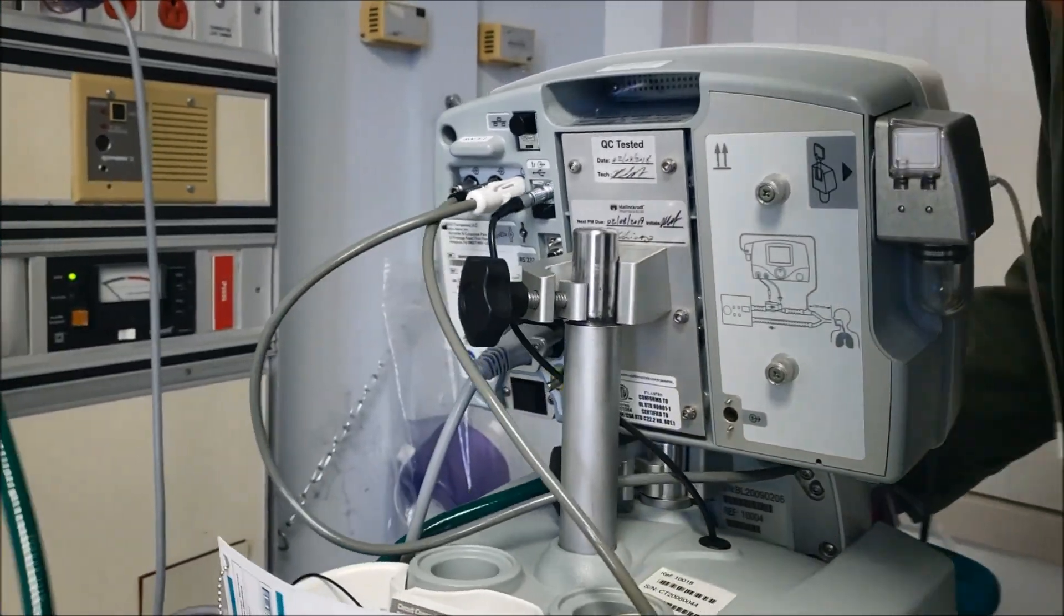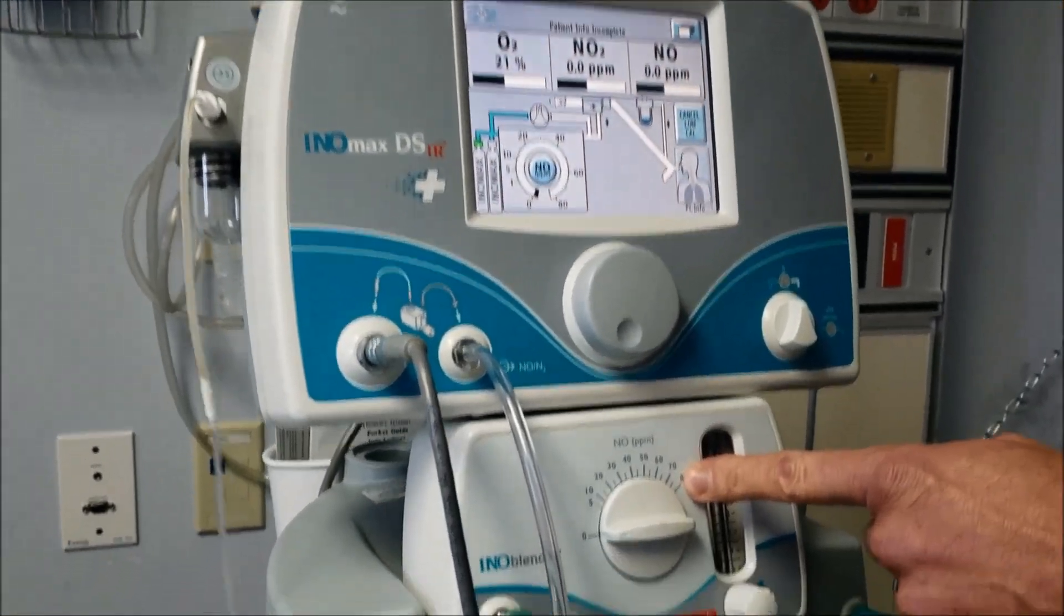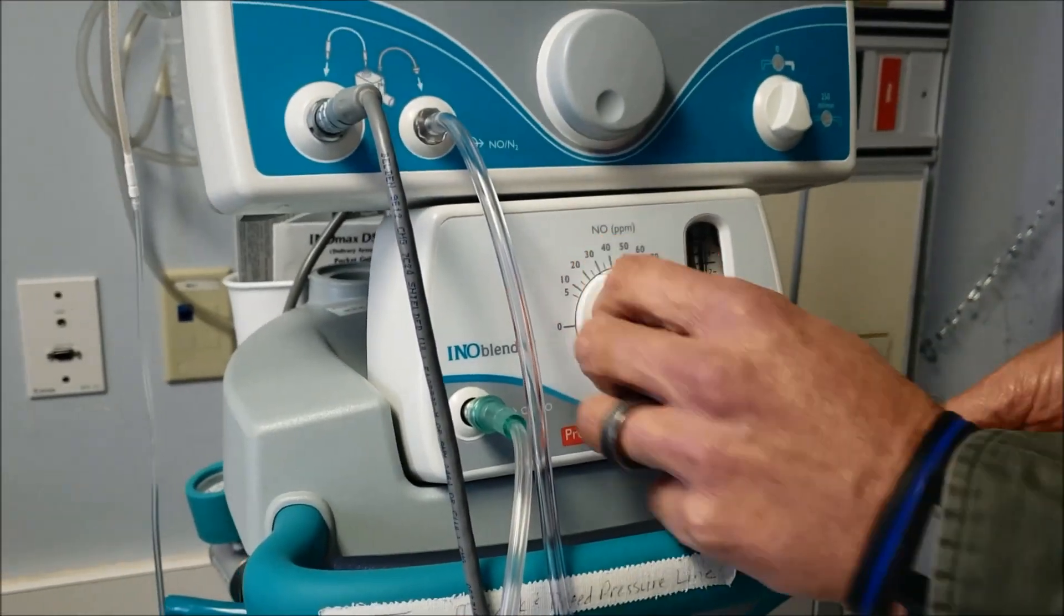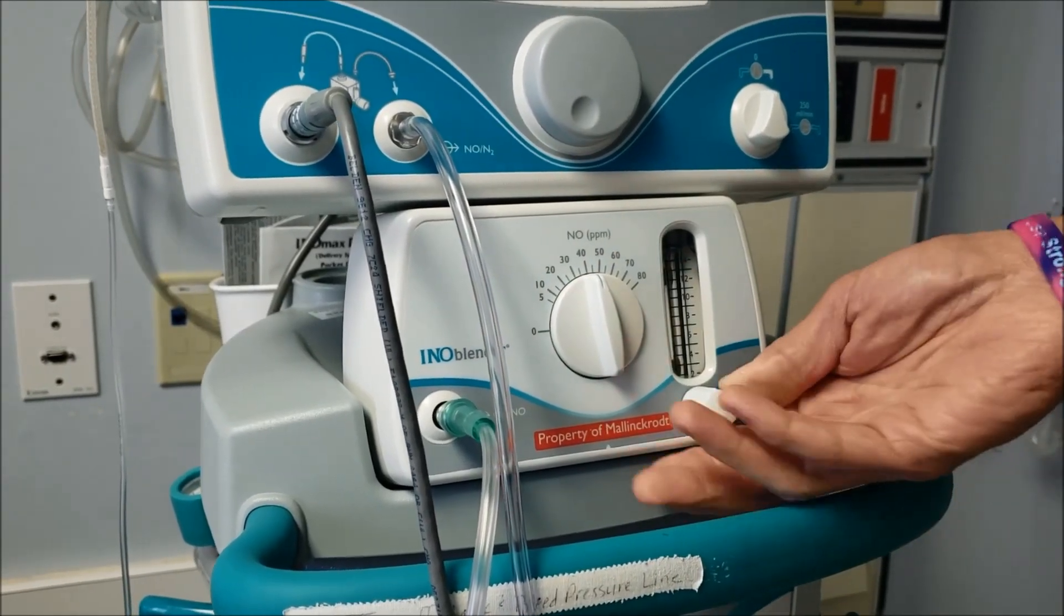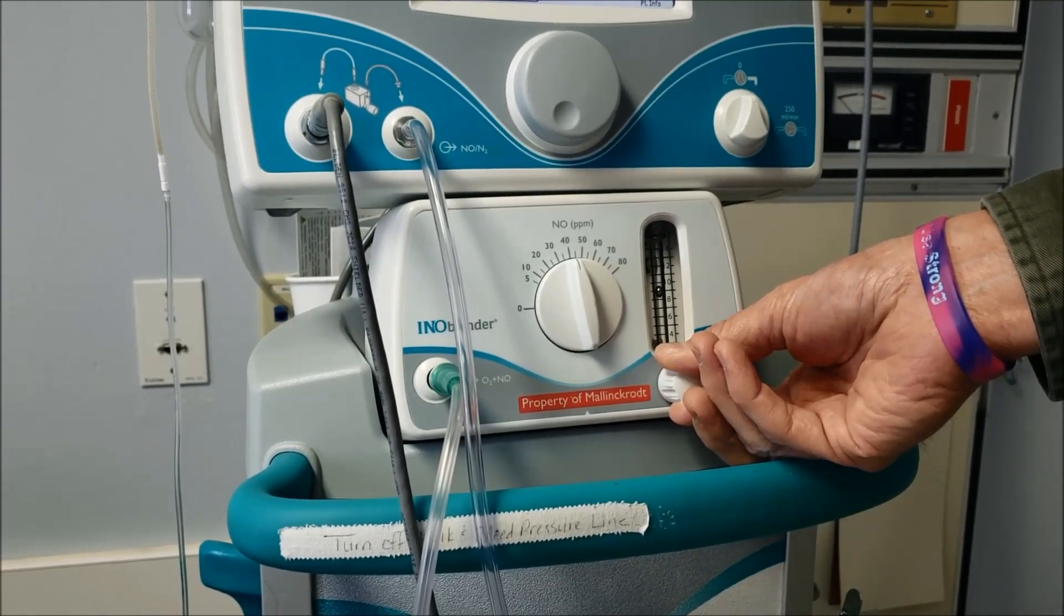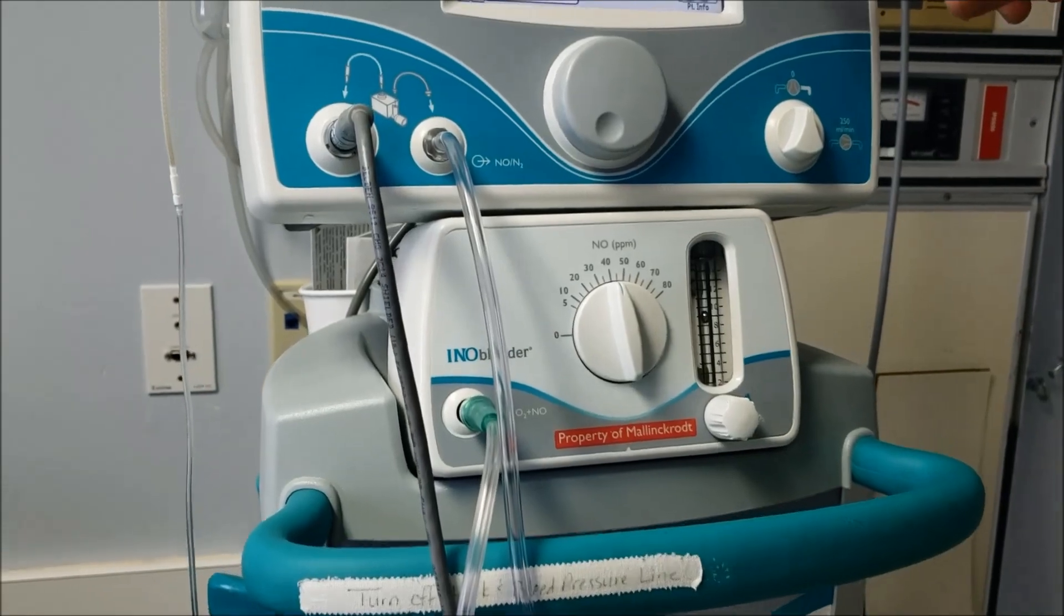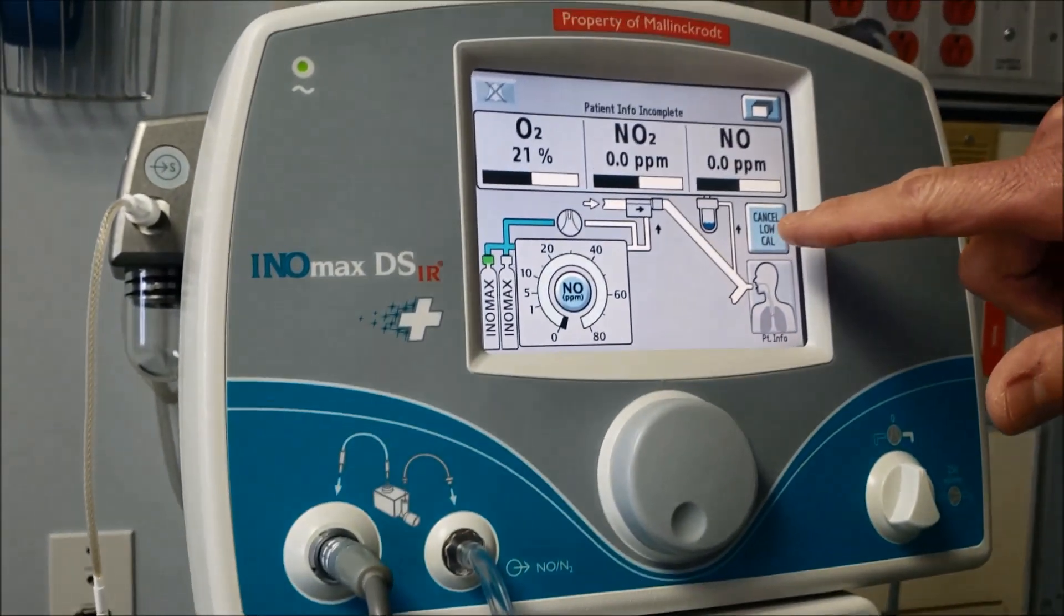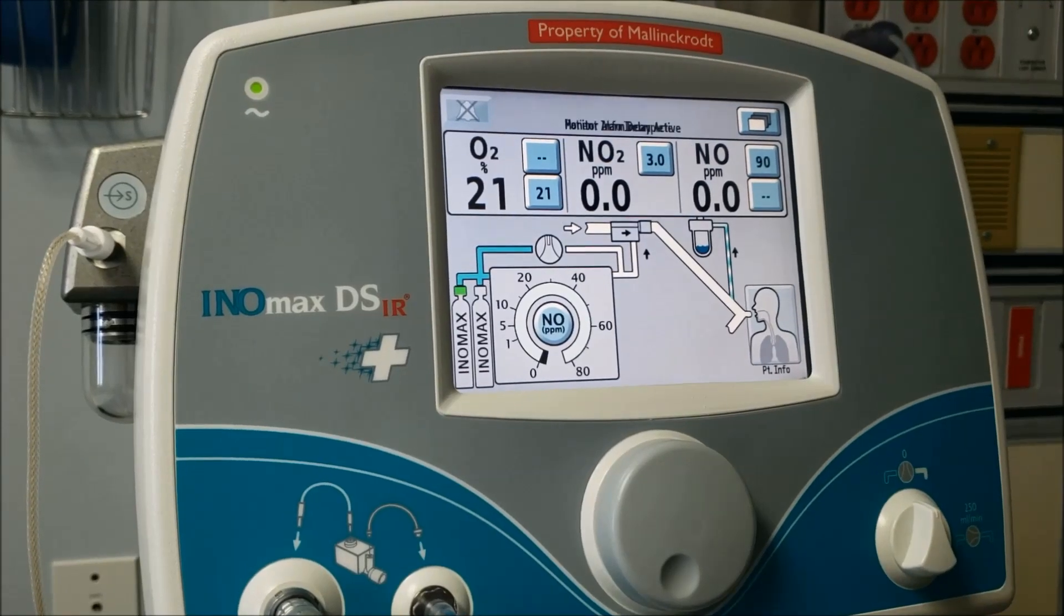If we spin the machine back around, we're going to set our nitric level here. And we want to start at 40 parts per million for a right heart study. So we're going to turn that on. We turn our flow on to about 10 liters per minute. And we're going to see that we're going to start getting some nitric readings here on our instrument panel.